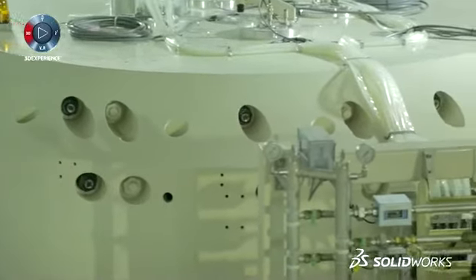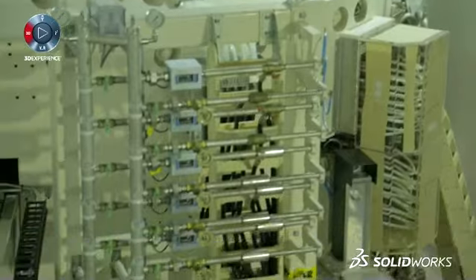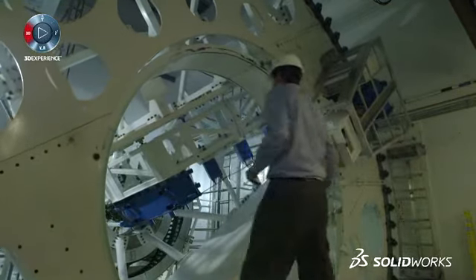People are often taken aback at the size. This is a 30-foot structure. The challenge is trying to steer an invisible beam down a line and trying to make sure all the equipment is coordinated and timed within a quarter second. These systems use about $1 million a year in power. You're essentially trying to mass produce a building and put the device inside of that building.